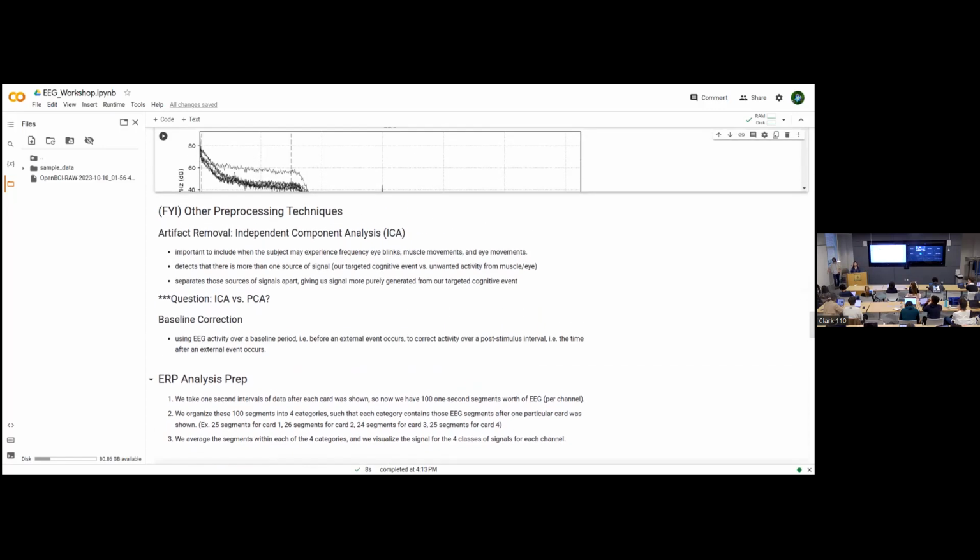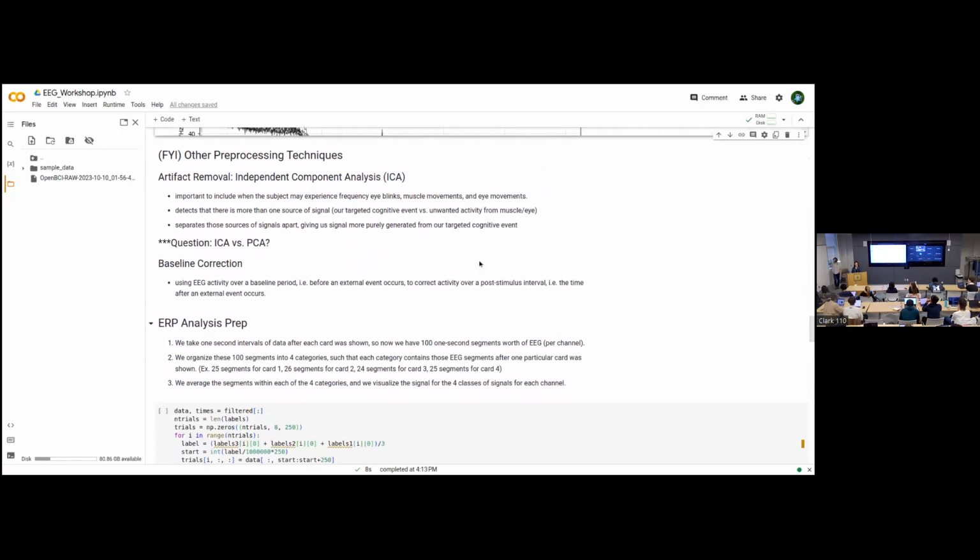Yeah, that's a very good question. Based on what I looked up, there are people who pay very close attention to data quality. What they do is put accelerometers around the eye region so that they can specifically capture those eye blinks and the signal correlated with them.